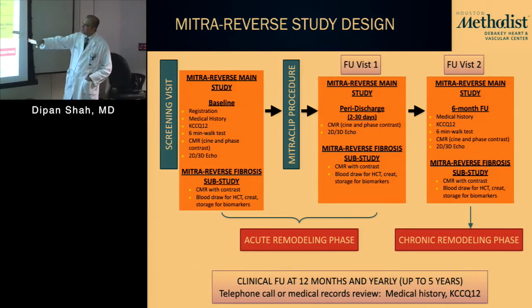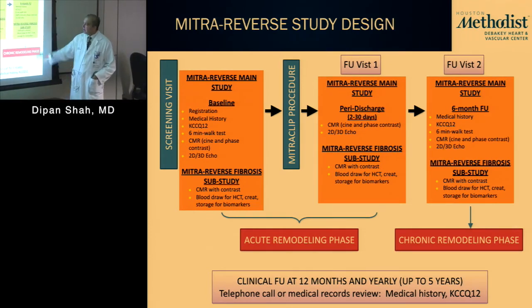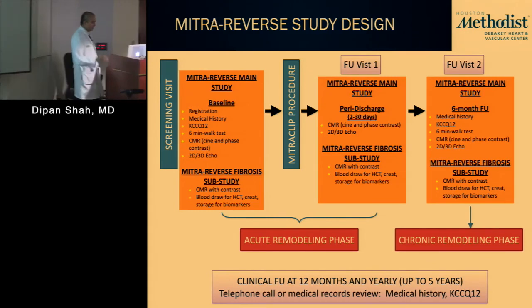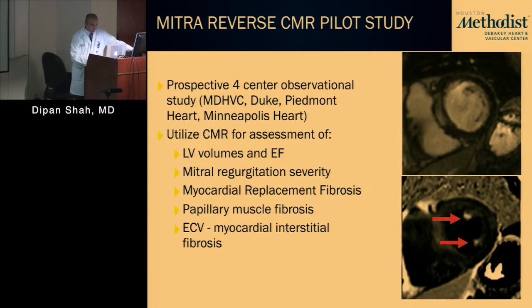And then these patients, after their clip, will undergo a follow-up CMR within the first week to look at acute remodeling, as well as a follow-up CMR at about 6 months to look at chronic remodeling that occurs. And then we'll also do clinical follow-up on these patients as well. So again, we're just getting started with this study. This is a project which we anticipate will run for about 2 years or so with initial enrollment.